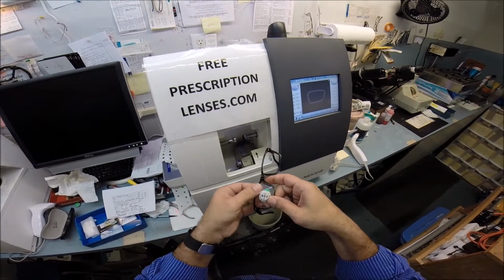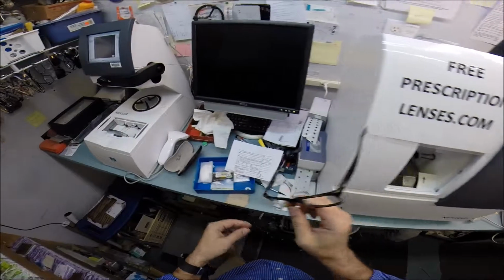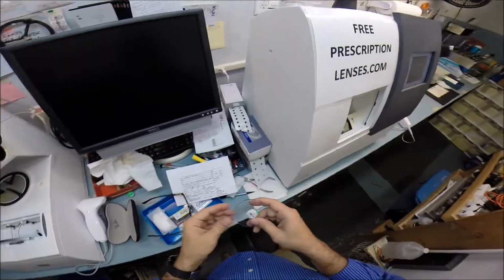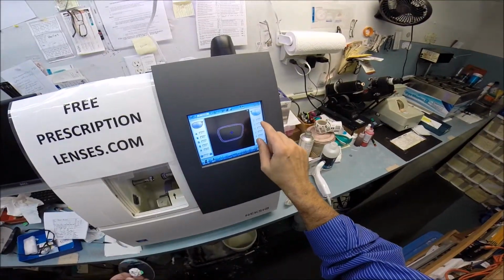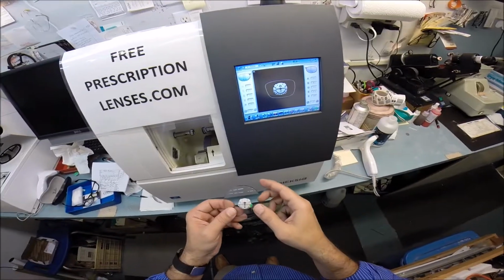So again, I'm going to tuck it in at the outside corner using my thumbs, press down at the nose. Now it snaps in easily. And if you notice, I did take it down 1/10 of a millimeter. If this were cut large, whoever ahead of me, that's what happened on the last person, and then you're just setting the next person up for failure, especially when I don't even get to touch the frame that I'm sending lenses for.